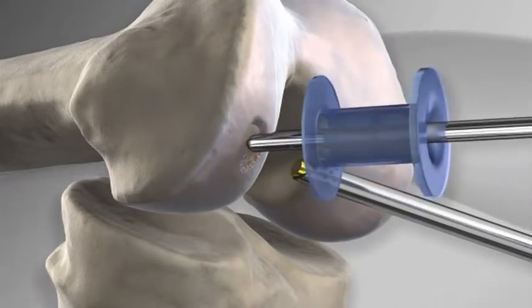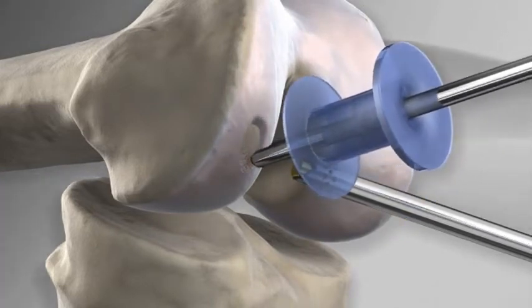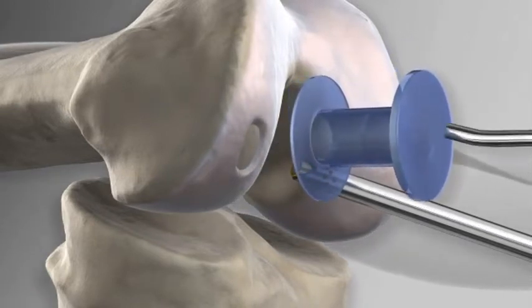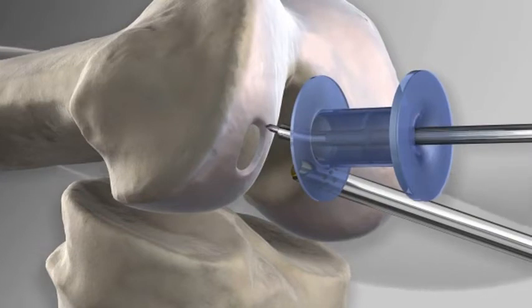The area of diseased cartilage is smoothed with a shaver down to subchondral bone. A rim of stable cartilage is created around the lesion and a chondral pick is inserted into the knee.